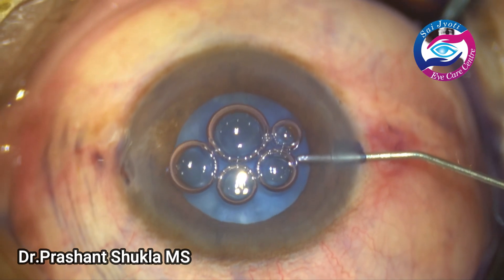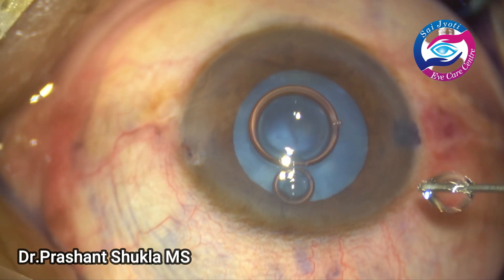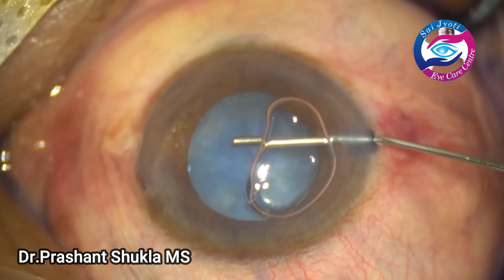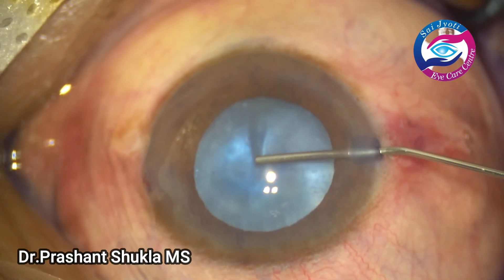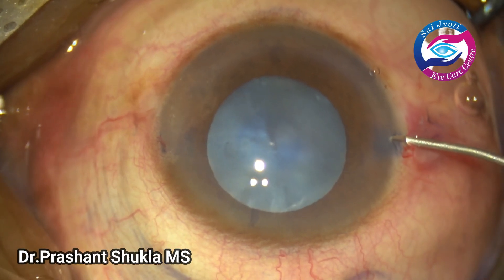Some phenylephrine is instilled to dilate the pupil a bit. Presently the dilatation of the pupil is about 5.5mm and I am pushing in heavy viscoelastic — sodium hyaluronate 1.4.